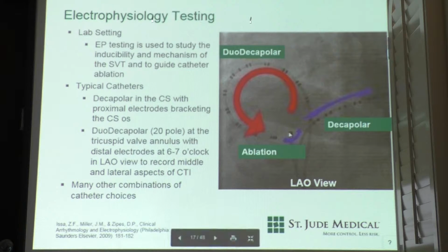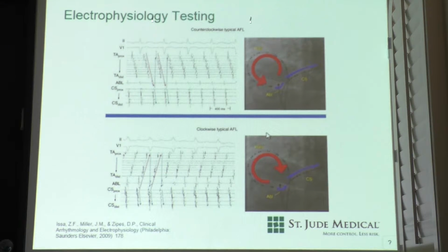What happens if you terminate the tachycardia while you're burning? You pace here, and it goes here first. Is it blocked? If it goes here, and then maybe here, and then it goes out here last, there should be a complete isoelectric blockage line here, because we burned it. But if it's going through, are we finished? We got more work to do. So that's just kind of one of the tools that's going to be done.